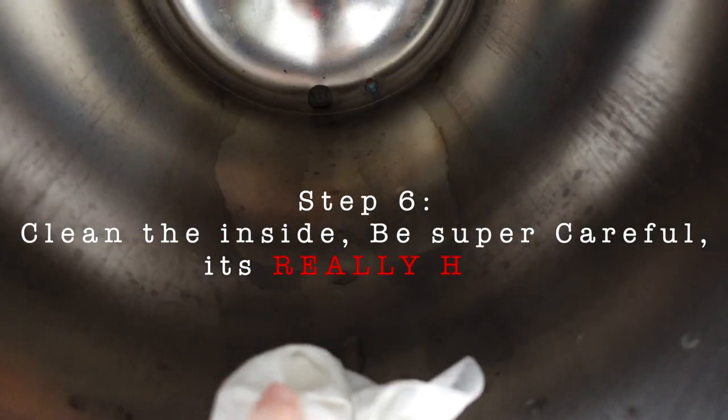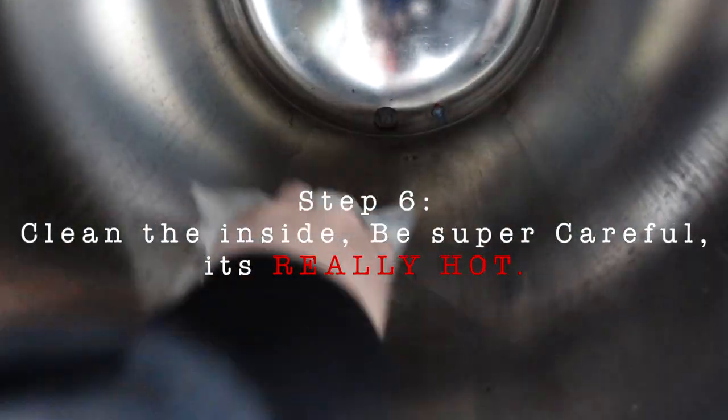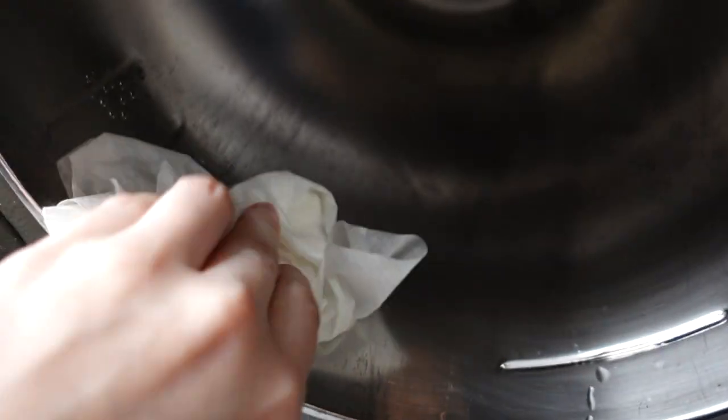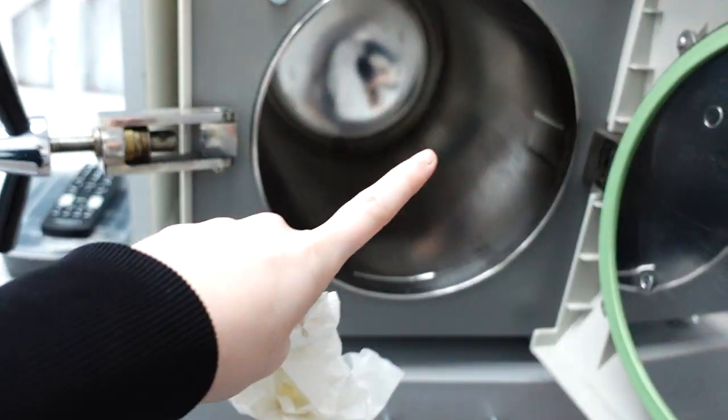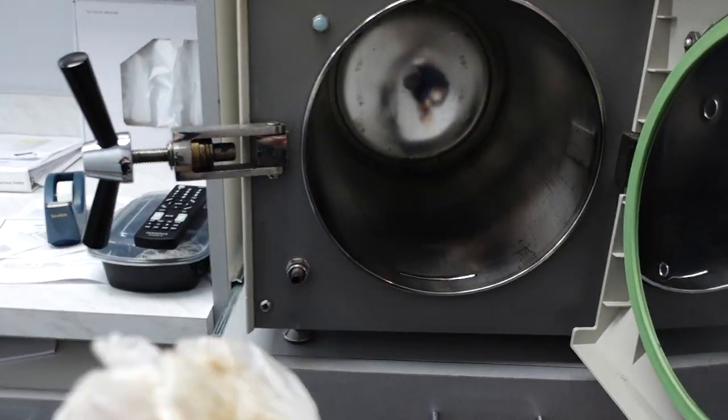Now I have some towels and I'm gonna just wipe the inside. You gotta be careful not to burn yourself though — just burned myself a little bit. You can see there's a nasty filter down there. You have to be really careful with this part because it's literally scorching hot.